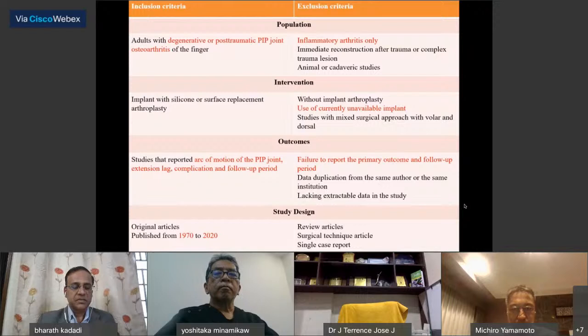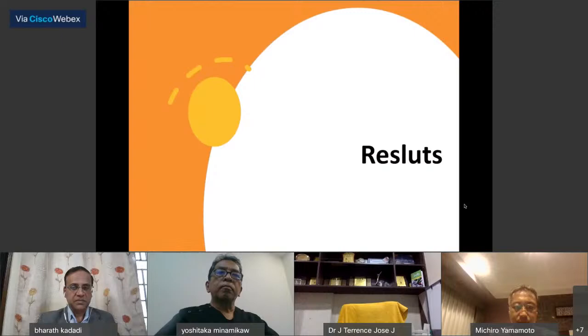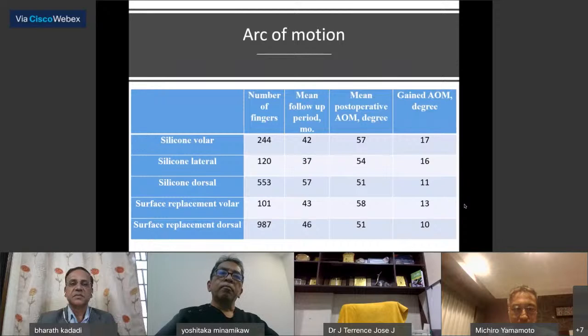Results. The arc of motion of the PIP joint acquired by the silicone volar approach was 17 degrees, which was the best result. The acquired arc of motion was 10 degrees with the surface replacement dorsal approach.